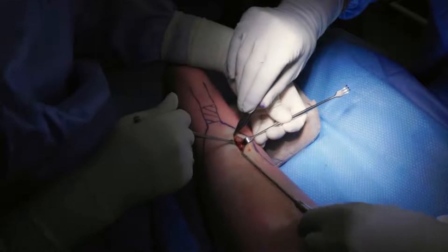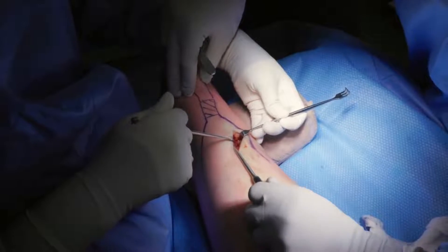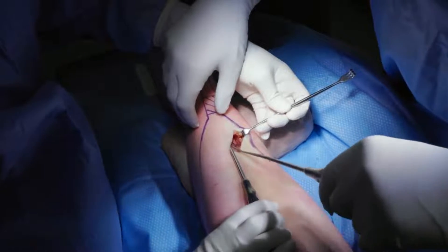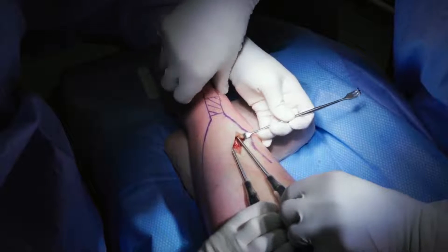The opening of the first curette is placed along the lateral border of the distal Achilles tendon, around 1cm proximal to the tendon's insertion onto the calcaneus. The second curette is positioned in an identical manner but along the medial tendon border.